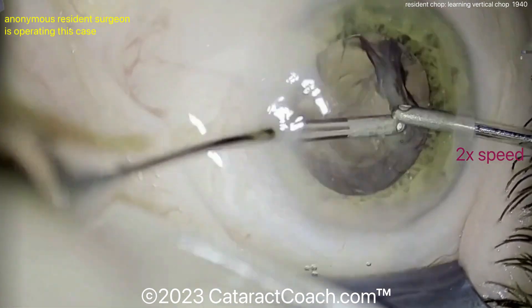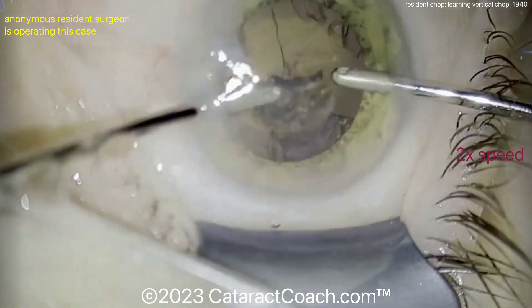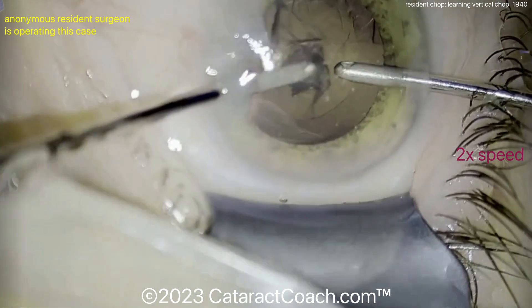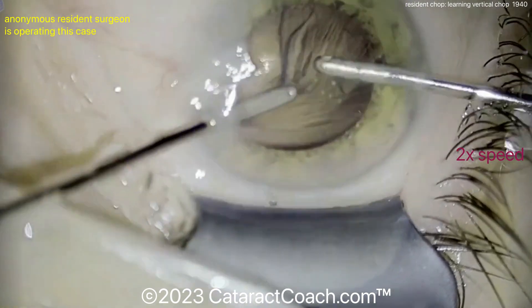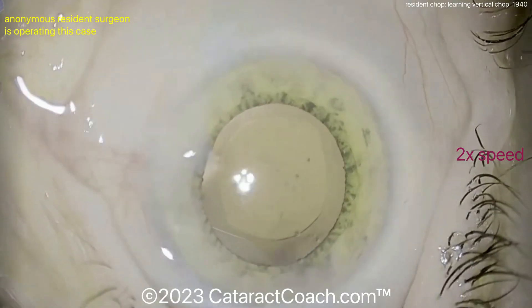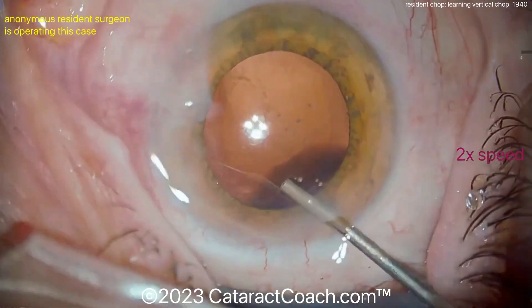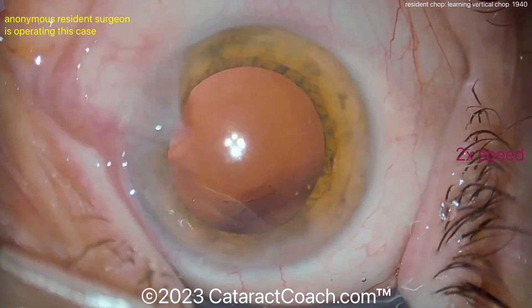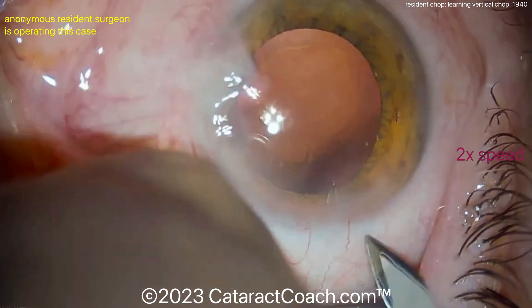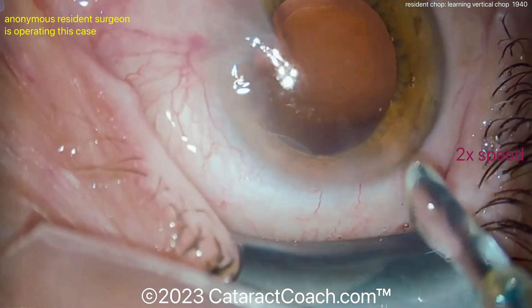Coming in with a bimanual IA to clean up all that cortex, and that's coming out pretty nicely. It's a nice case — don't get me wrong — but I think you can improve more. The one thing that drives me nuts is your instruments touching those eyelashes the whole time. You've got to get the eyelashes out of the way, get the lid margin sequestered. It's going to have a better outcome for your patient, less risk of endophthalmitis, and it's also just easier to operate with a clean tear film without all the particulate matter.